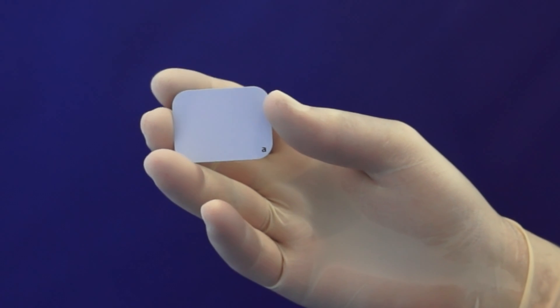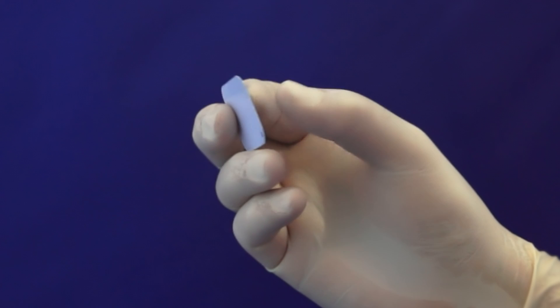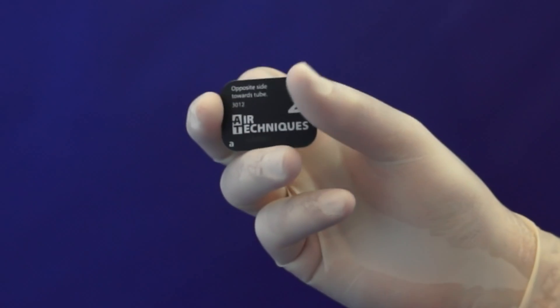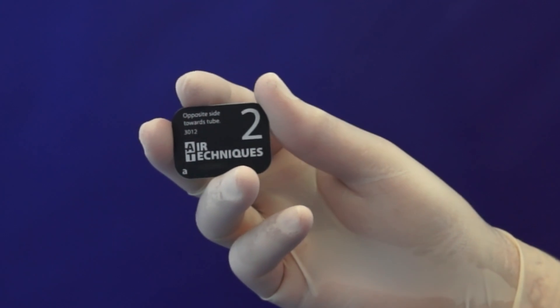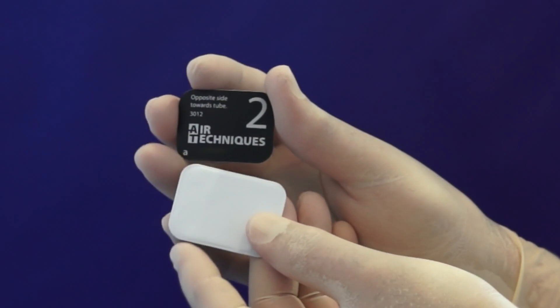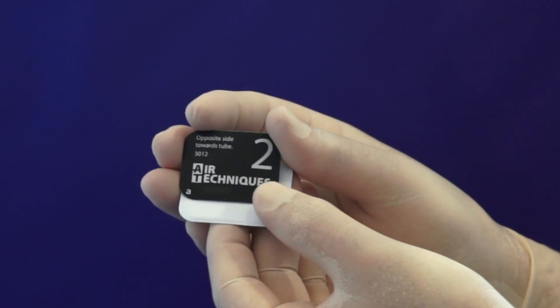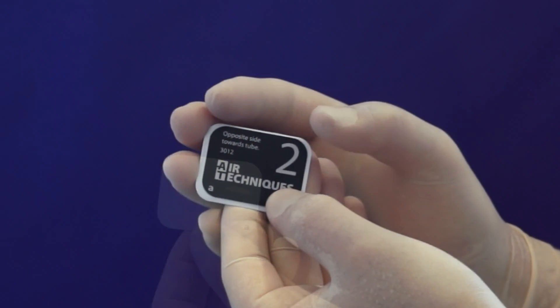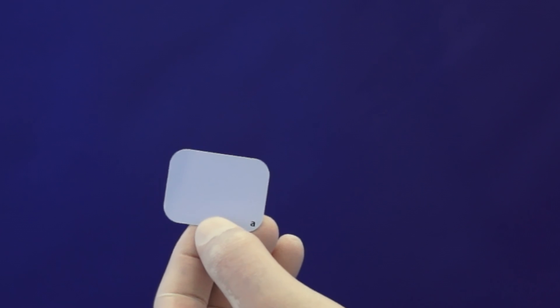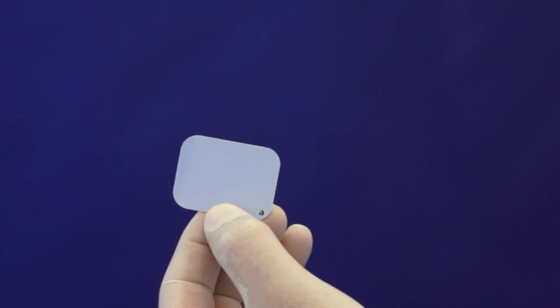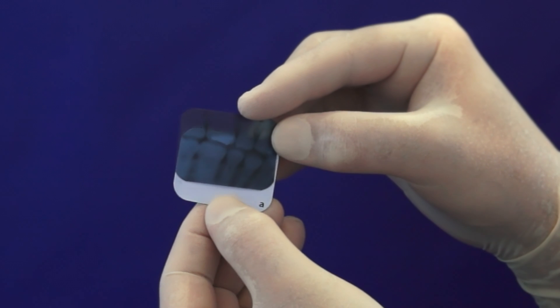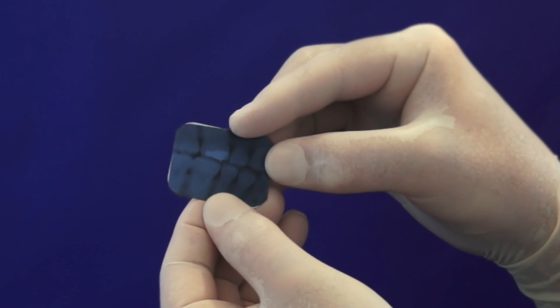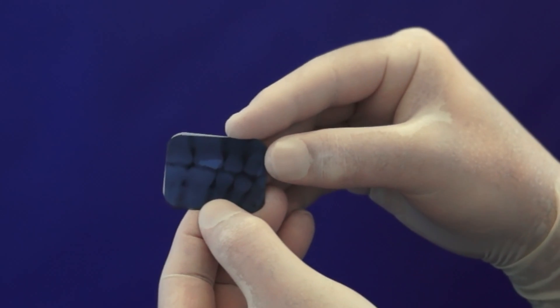The ScanX sensor is very easy to use. This is the number two size sensor, which corresponds to the traditional bite-wing film. Here is the bite-wing film size, and it's approximately the same as the ScanX sensor. In comparing the size of our phosphor plate sensors to our traditional analog films, you can actually see that the traditional bite-wing film is just about the same size as our number two ScanX sensor.